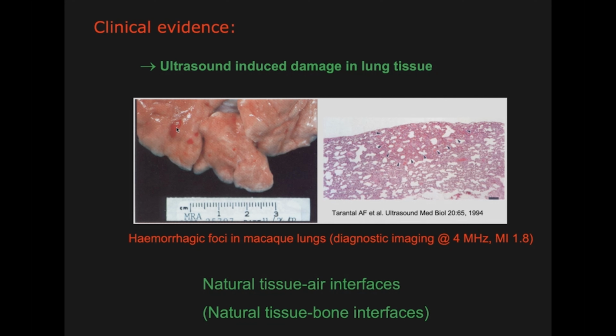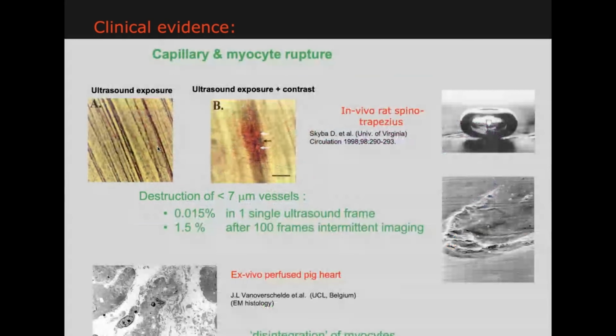You really get a little gas bubble which implodes, and we get a small local bomb of about 10 micrometers, which is exploded there at very, very high energies. And that can cause some tissue problems. So we always have to take care when we have an interface between tissue and air, especially at the lungs, that this can do some damage. For example, newborn babies that have lungs filled with blood and very fragile tissue, we have to make sure that we don't use too much ultrasound at high energy, because it can create some damage.